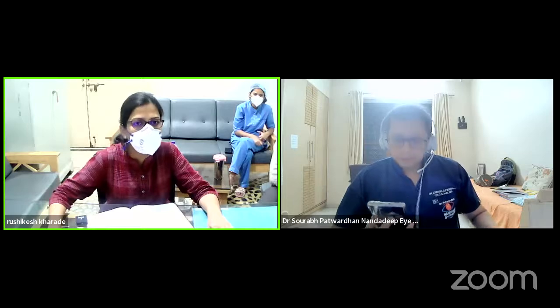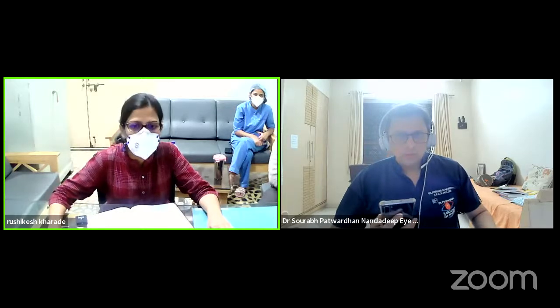Now I'll show some videos of IOL implantation complications.